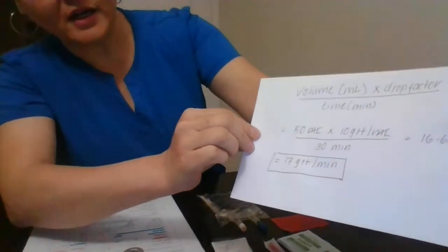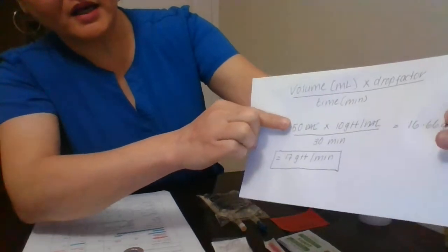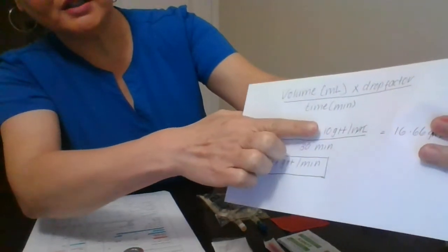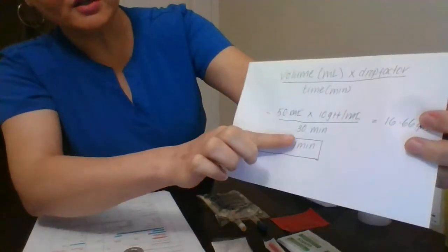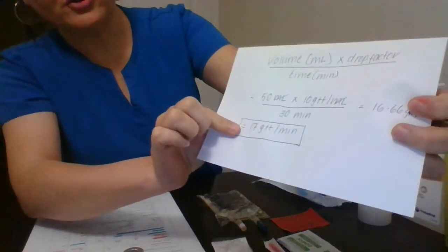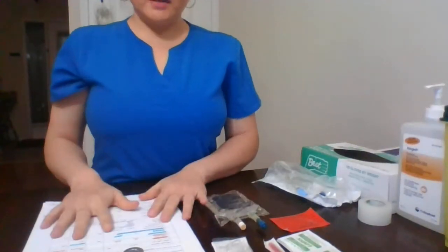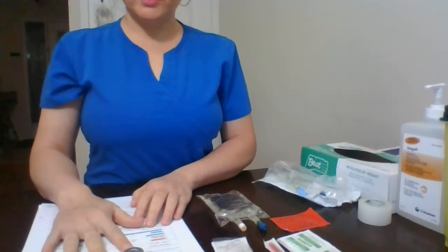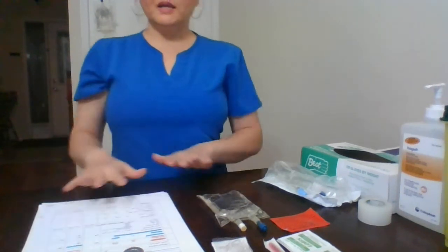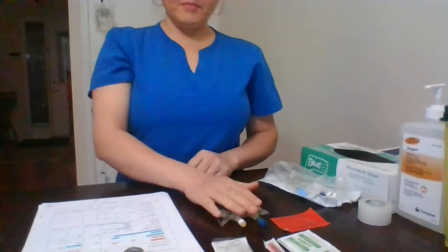So we have our calculation here. We have our mini IV contains 50 ml, and the drop factor is 10 GTT per ml, and then this needs to be administered within 30 minutes. So we have 30 minutes, and our drop rate would be 17 GTT per minute. Since I've already compared all my medication with my order and my patient's MAR, now we are ready to insert the medication in our mini bag.